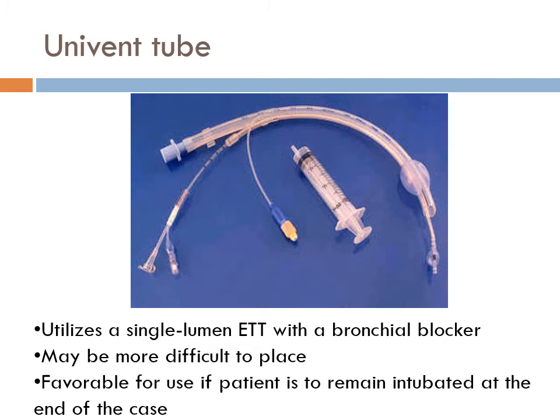Life is great. If they end up not being extubatable and you're going to send them to the ICU, which most patients are going to go to anyway, you can do a tube exchange. Has anyone ever exchanged a tube before? No? Okay, let's talk about it.